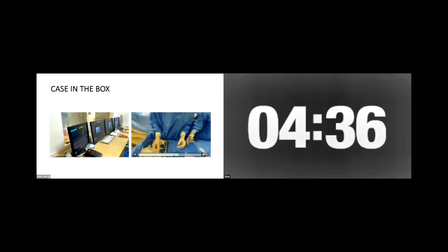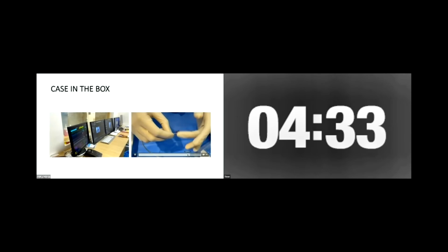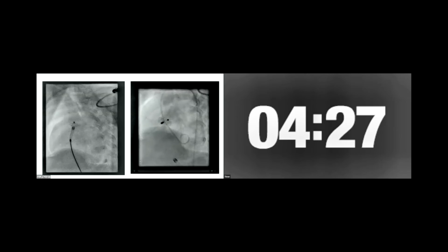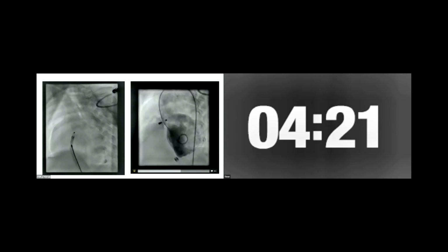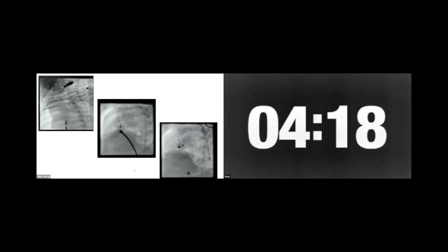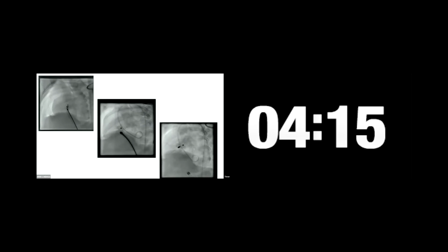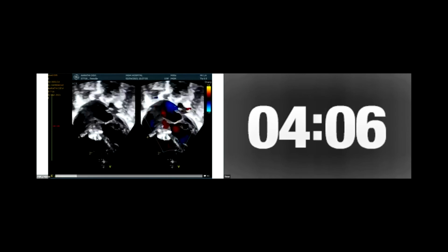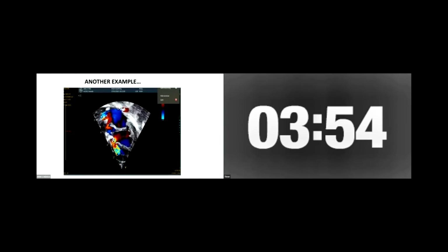So this is a membranous VSD, an 8 millimeter VSD we are loading, a double disc device. From the antegrade route, the post VSD device angiogram showed a good result and not much residual. Echocardiography in the follow-up showed trivial TR, which was almost the same as pre-procedure. Definitely there is no aortic regurgitation, the VSD device is in position, and there is no residual flow. This is the child, 5.2 kg, who has now gained to 8 kg in a span of 4 months.